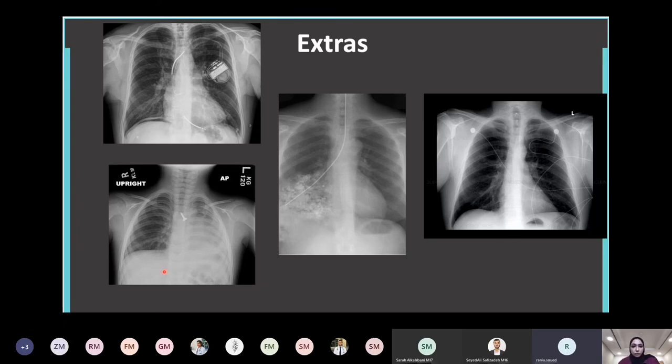Is this an ulcer, for example? Is that a duodenal ulcer that is giving a small amount of air? Because the small bowel would usually leak only a small amount of air, versus the colon would be a huge amount. So a small diverticulitis that is perforated can give a huge amount of air in the abdomen.